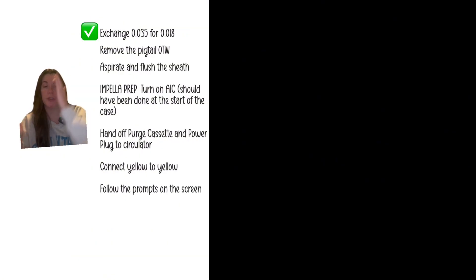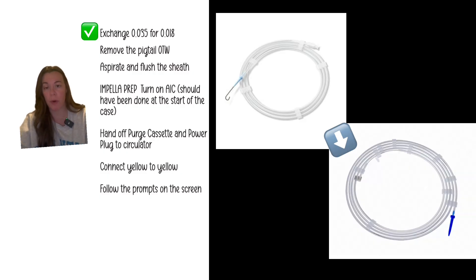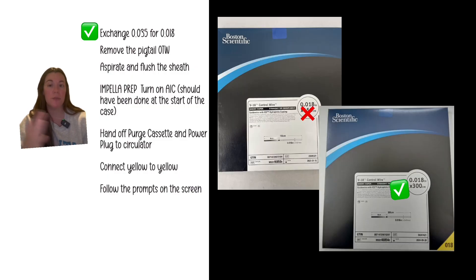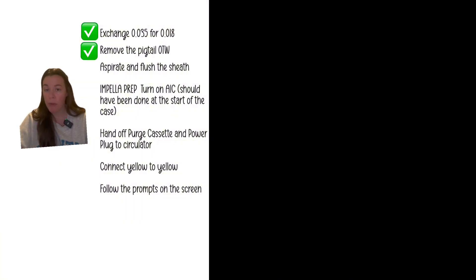Next, perform a wire exchange: swap the 0.035 wire from the pigtail for the 0.018 wire in the Impella kit, because the Impella goes over an 0.018 wire. If you lose the 0.018 wire you can use a V18 peripheral wire — just make sure it's over 260 cm long. Remove the pigtail over that wire, then aspirate and flush the sheath, because it's a large sheath and you likely have clot in it.